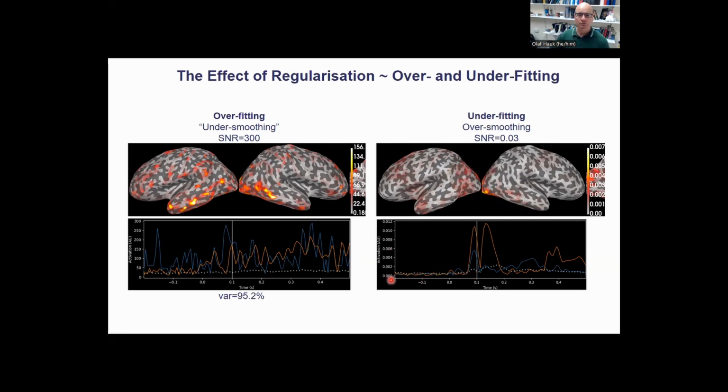The time course in source space: flat baseline, evoked responses, maybe the later responses here have been smoothed out. And look at the scale, very much lower than before. So we've clearly suppressed our amplitudes. We may have smoothed a bit more than necessary, but at least the source that we are interested in is still there. But it's not really clear what would have happened if there had been more subtle sources of interest, maybe nothing as big as the visual evoked response along the temporal lobe or something like that. So obviously we may have lost some information. We might just not see it in this particular image here.